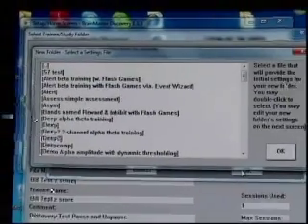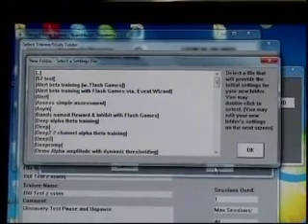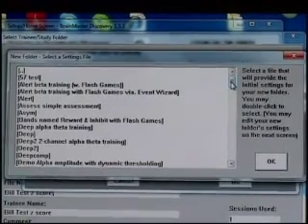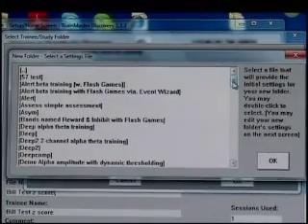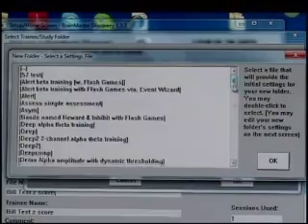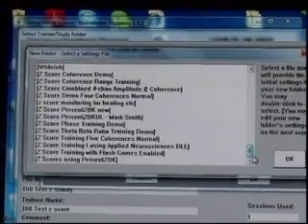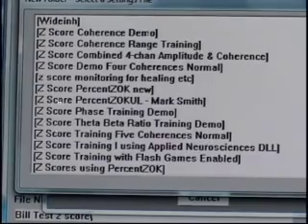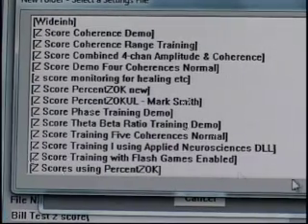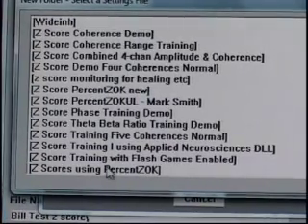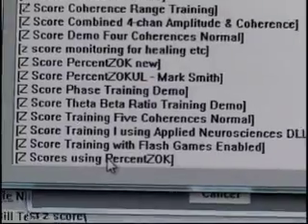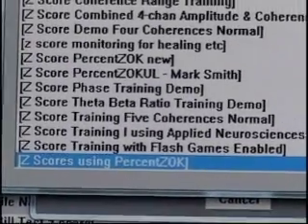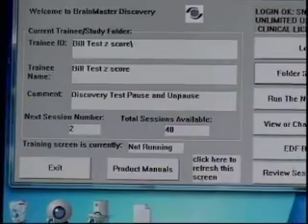Then it's going to ask us what settings file we'd like in here. To start, because it's a z-score and these are alphabetically listed, let's scroll to the bottom to see what's available. What I'd like to do for this particular protocol is go ahead and start with the simple z-score using %ZOK. I highlight it and hit OK.